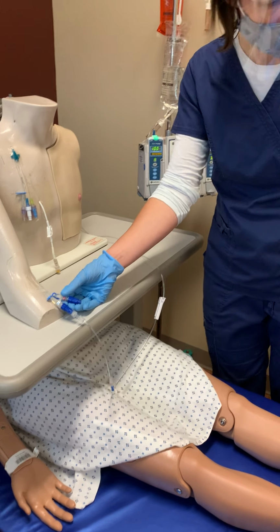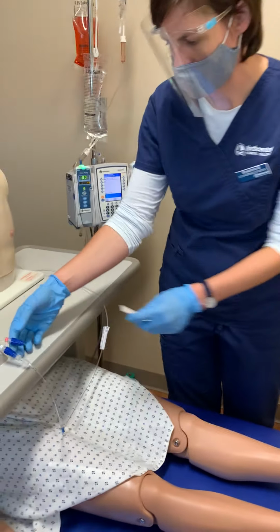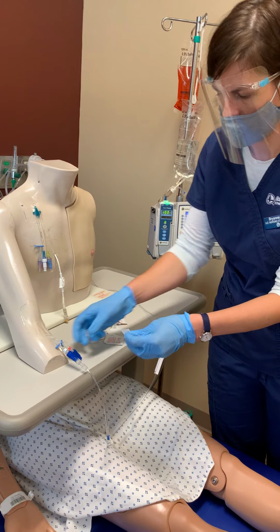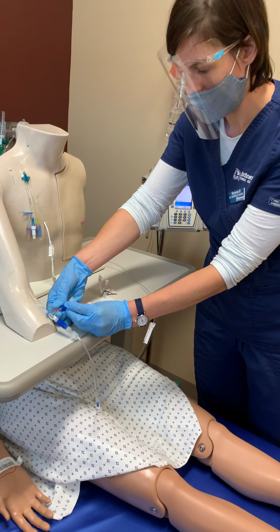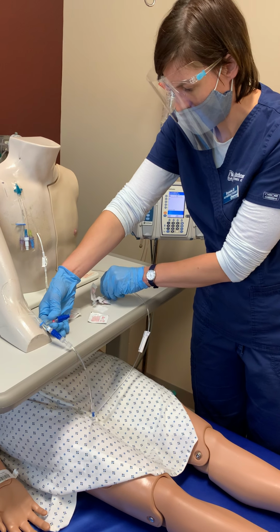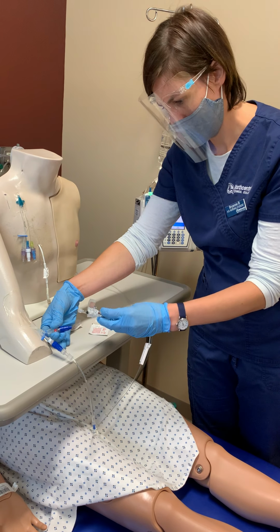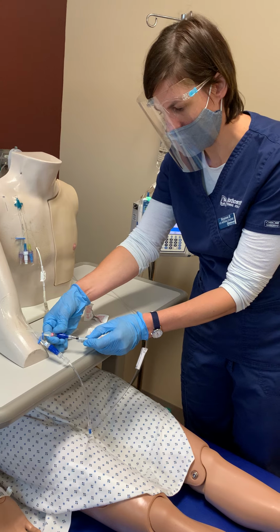Okay, so that one's good. I can throw this in the garbage. I would re-clean. 15 seconds, let it dry. Now I can give my morphine. And it's dry. I'm going to connect.